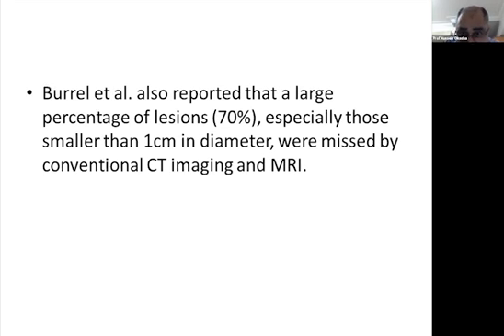This encourages us to start our prospective study on that item, I think 5 to 6 years ago, and now we have reached more than 700 patients with malignant lesions in the pancreas, lung, esophagus, stomach, peritoneum, and the results are very promising, and the results will be available in a very short time.